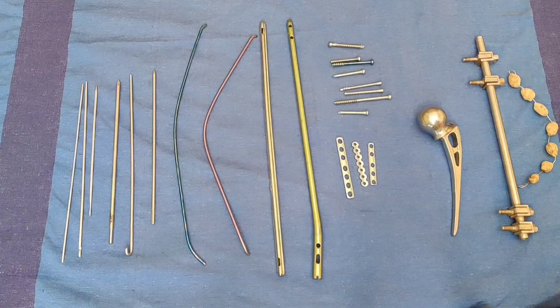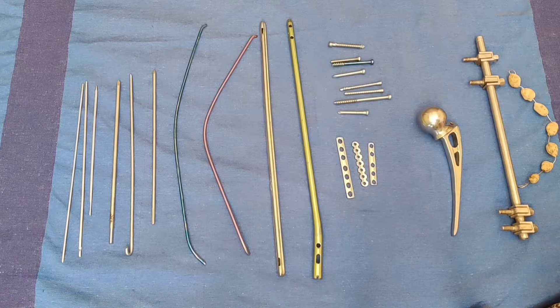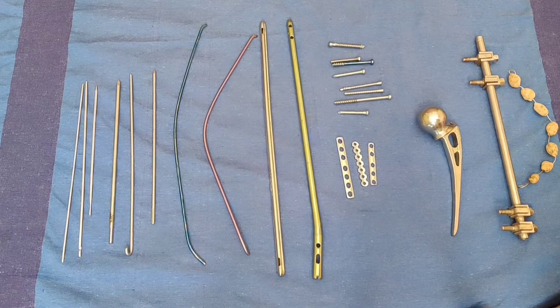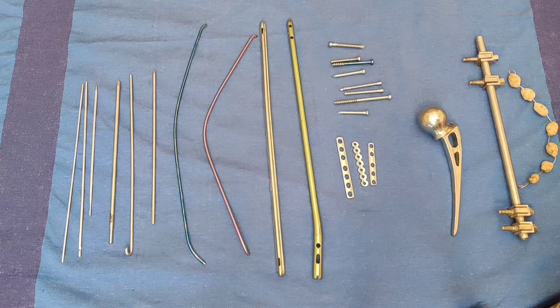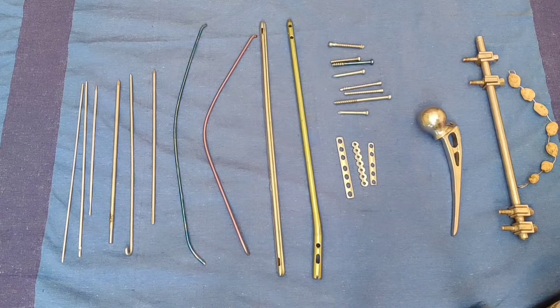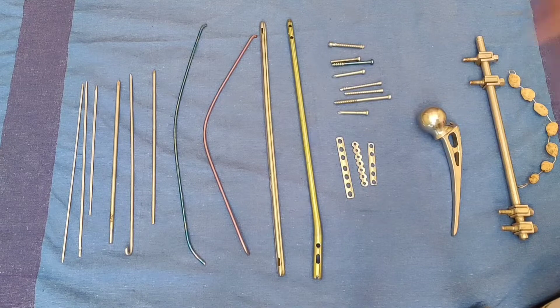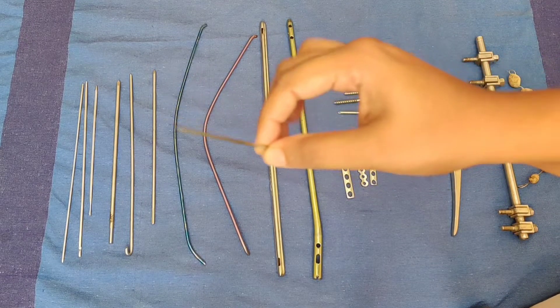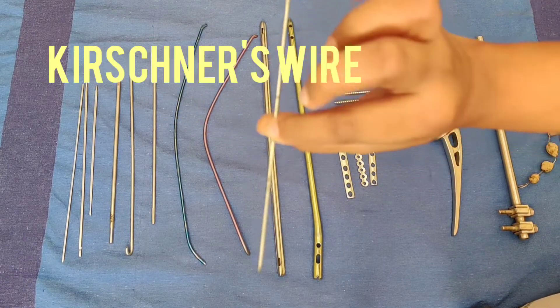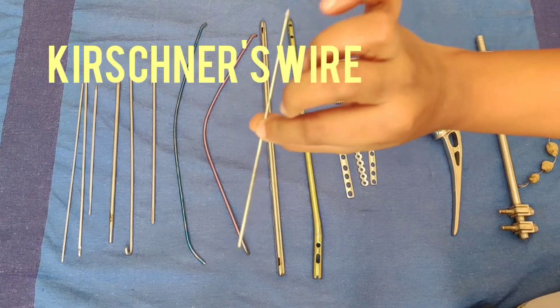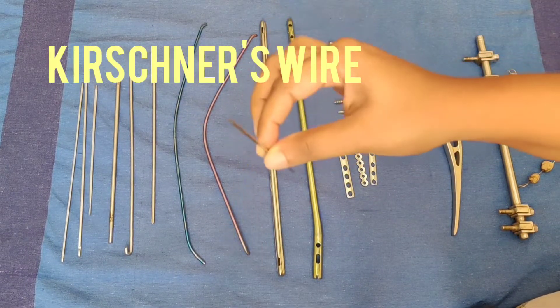Hello friends, today I will discuss a few orthopedic implants which are commonly kept in clinical orthopedic examinations. First we will discuss the K-wire or Kirschner's wire.